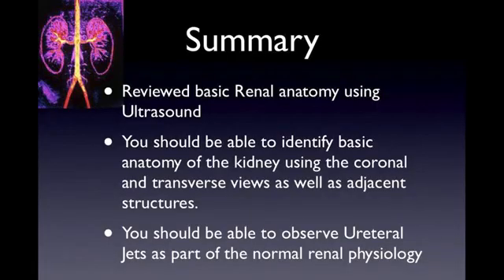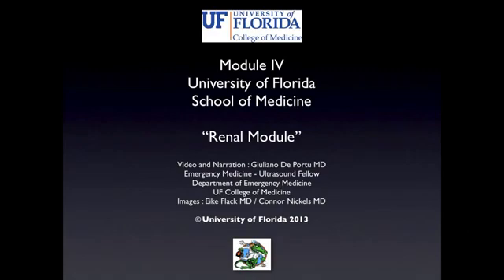So in the lab today, you were able to visualize renal anatomy, take measurements of a kidney, look at the bladder, see urine flow from the kidneys into the bladder, as well as some anatomical structures that are adjacent to the kidneys. Thank you for your time.